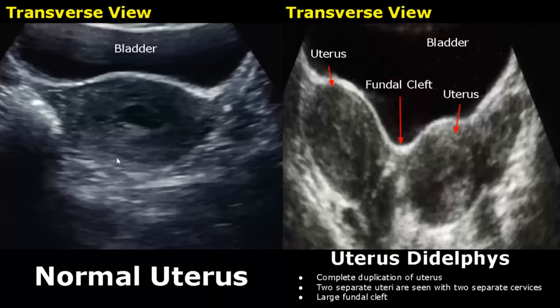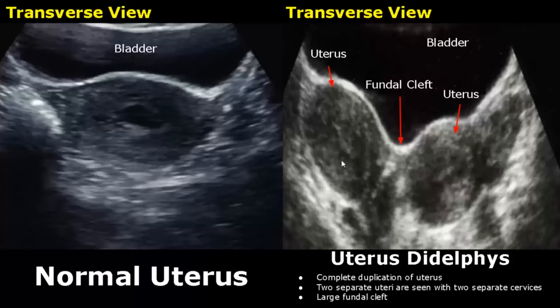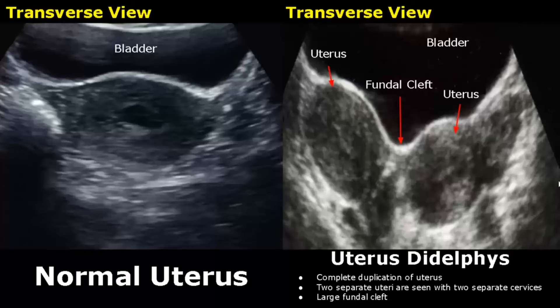On the left side is a transverse image of a normal uterus showing the normal myometrium and normal endometrial canal. The bladder is anterior to the uterus. Over here is uterus didelphys, in which there is a complete duplication of the uterus — we see two separate uteri with two separate endometrial canals with no connection between them. There will also be a large fundal cleft, which is seen better on a 3D ultrasound coronal image.